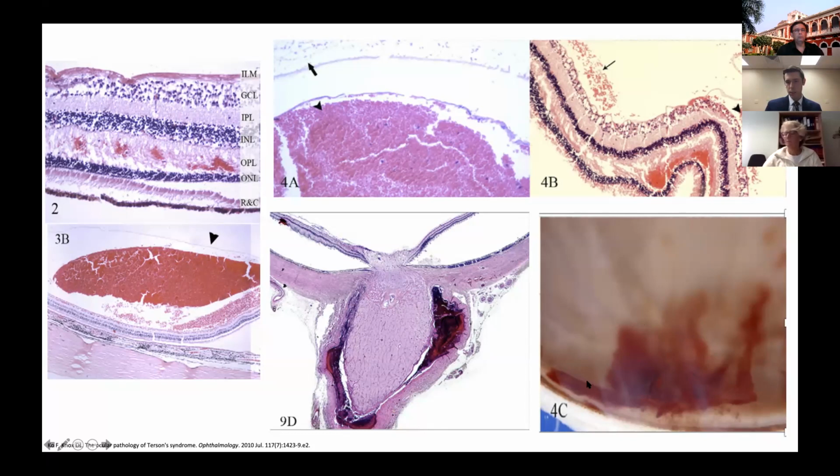So if you did a B scan, you can almost get fooled seeing this line and then having this amorphous substance under it, and like, gosh, what is that? But that's just that subhyaloid hemorrhage. I've seen a numerous amount of patients like that on call too. So a good gross specimen of that.